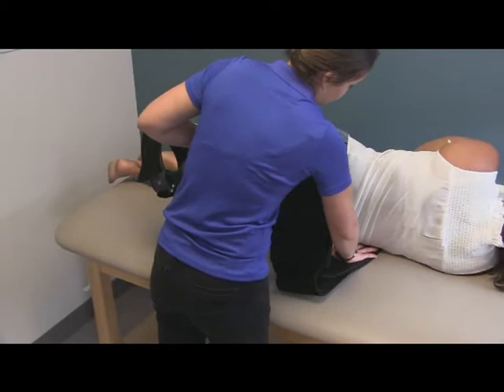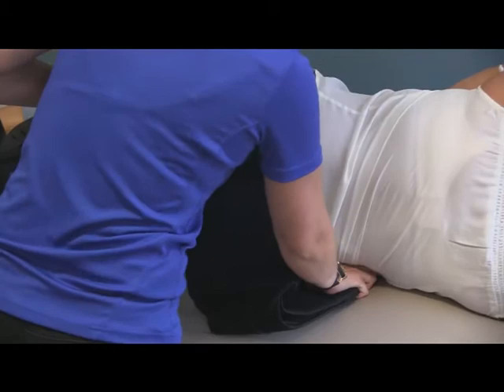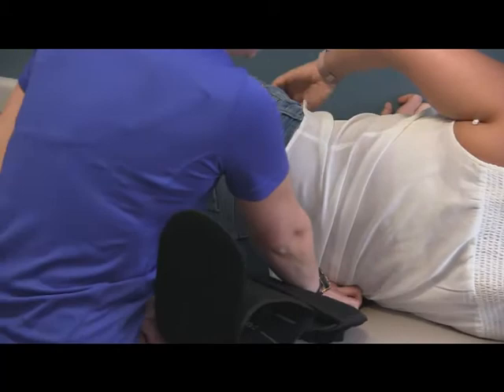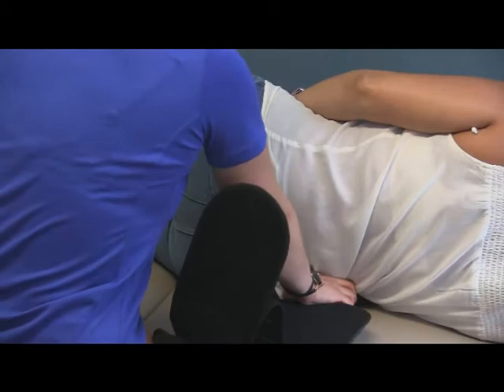We are going to tuck the portion of the waist belt underneath the patient's right side at her waist. Her waist is located between her hip bones and the ribcage in the soft fleshy part. This gets pushed under until the square back panel is centered along the middle of the back.